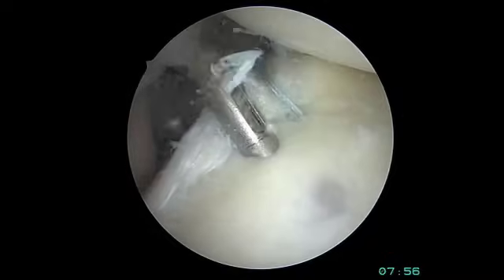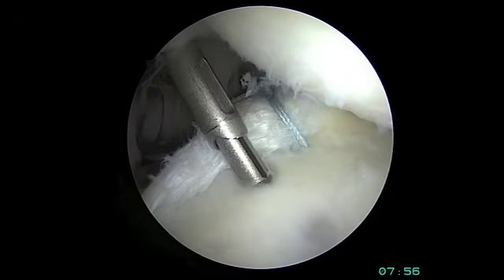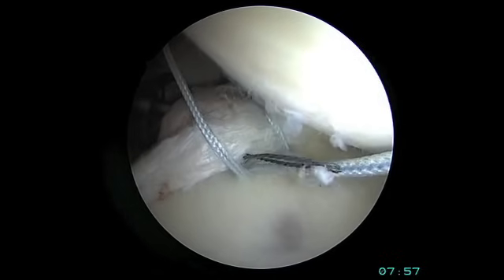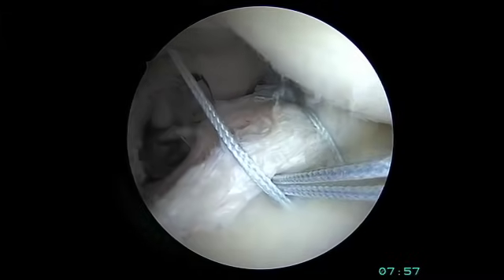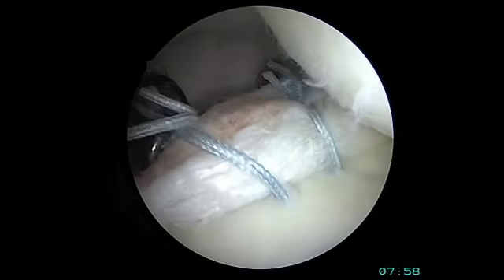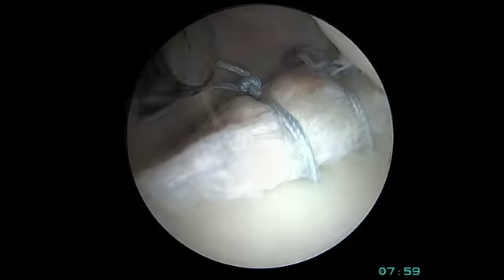The next suture anchor is placed slightly more proximal on the glenoid. The same anchor is utilized — these are very small 2.4 mm diameter absorbable anchors; the body resorbs them over time. The same type of suture passing device with the wire loop is used, grasped with the suture grasping forceps and shuttled back through the torn labrum. The same locking sliding knot is tied, with the knot pusher providing appropriate tensioning, followed by half hitches and precise suture cutting.